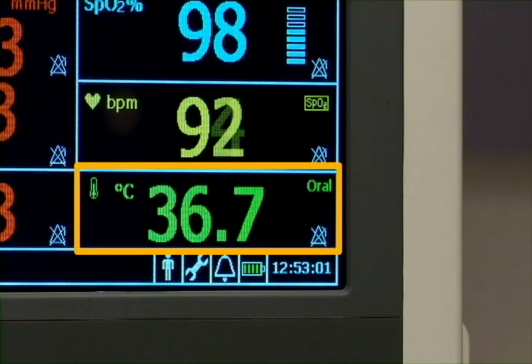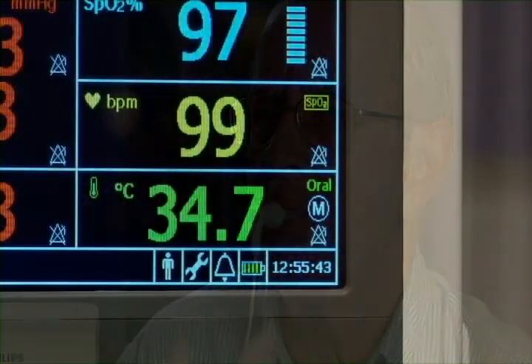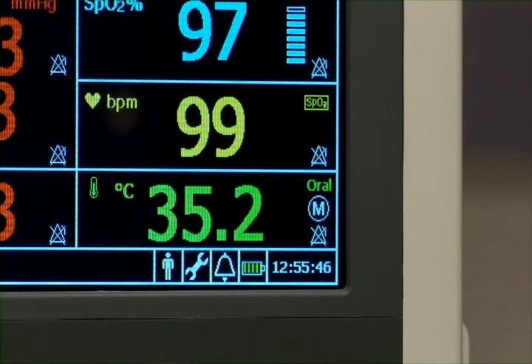Temperature is displayed on screen. In monitored mode, the VSI measures the patient's temperature continuously and displays the temperature in the numeric pane as long as the probe is in contact with the patient. It is recommended that the probe not stay in the mouth for more than 3 minutes.